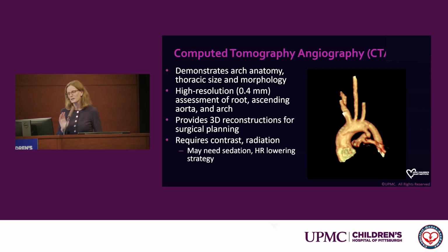I'm going to spend a couple minutes on this slide. Part of the strategy here is understanding the risk and benefit of how you're going to image, what information you need beyond echo for your patient, and then how you're going to pay for that. I'm not talking about dollars. I'm talking about exposures to your patient.